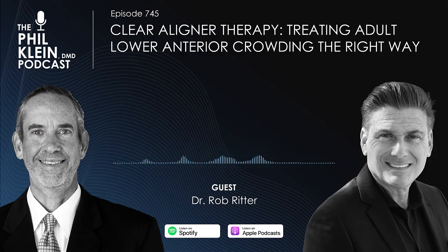So you have to open up that case. And then what I do is I just look at the arch and I say to myself, posteriorly, the arches need to be brought out in the buccal corridor. And then I make it look more in the incisal view. I tip it and I go, well, that tooth needs to turn a little bit more and that tooth needs to be here. And I make all those tweaks to it.